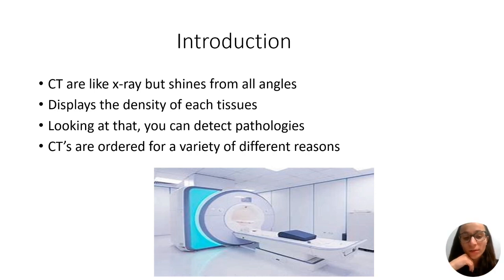What are CT heads ordered for? A CT head is generally ordered for head trauma to rule out bleeds, strokes, and neuro symptoms like altered mental status, and also for monitoring brain tumors, infections, hydrocephalus, stuff like that.